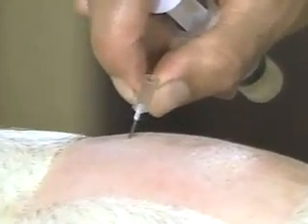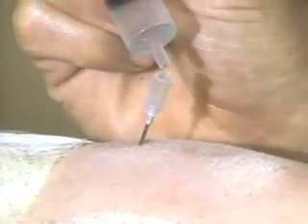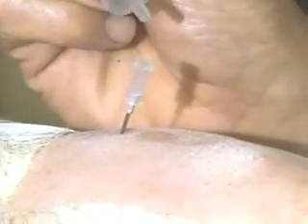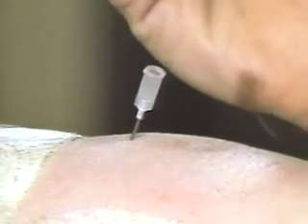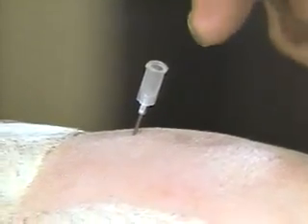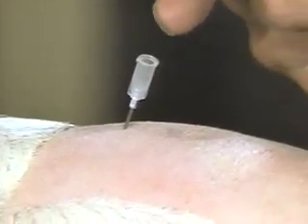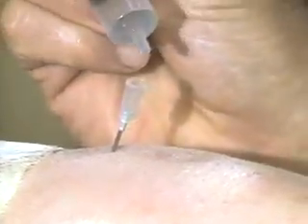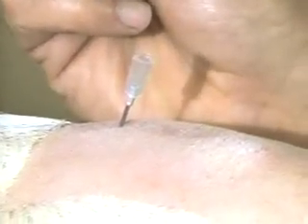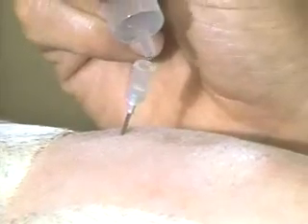I've withdrawn it just a very small amount. One test is to put a small drop of the local anesthetic in the needle — if it pulls it in, as it did there, almost for certain there's an area with a slight vacuum, and that means it's the epidural space. I'm putting several drops in and they're all disappearing down into the needle, so that's the correct site.